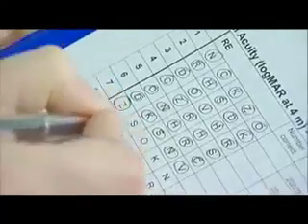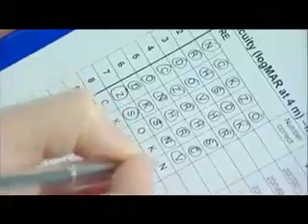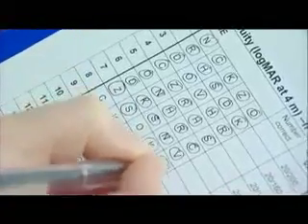The patient continues reading down the chart to the last letter of each line until they make three errors on a given line, despite guessing. The incorrect letters can occur at the beginning, middle, or end of the line, and do not have to be consecutive. The 4-metre test is completed when the last letter on this line has been attempted, and it must be conducted for each eye.